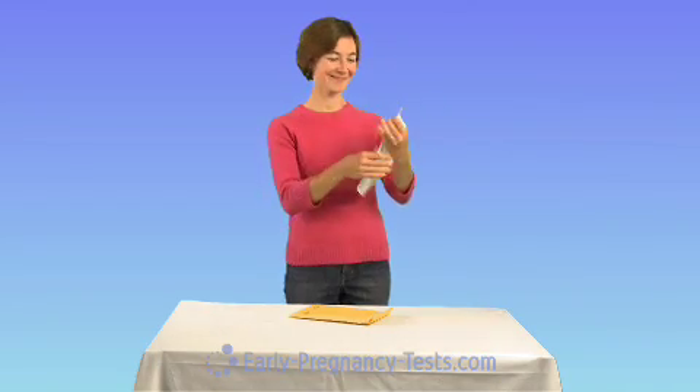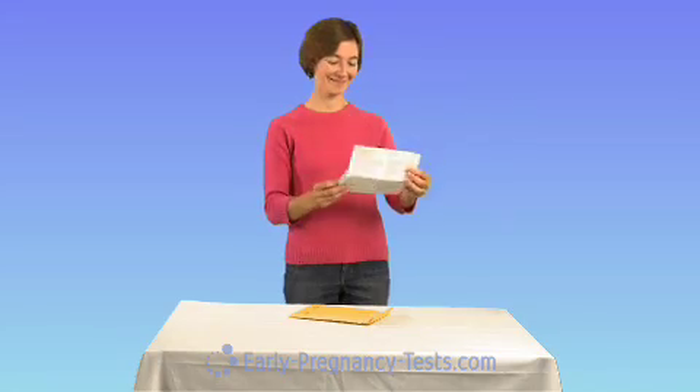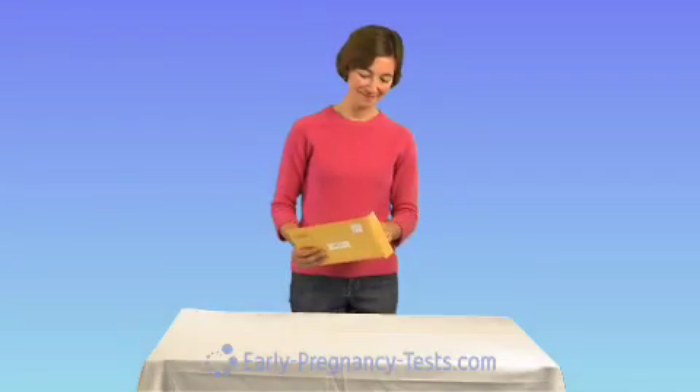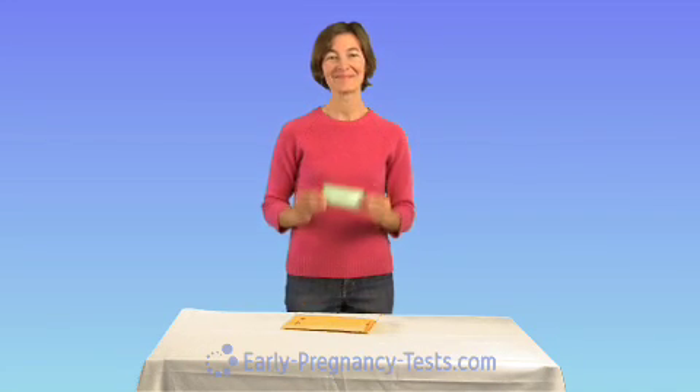When you open your package, the first thing you'll notice are the test instructions, complete with images to help you interpret your results. Please be sure to read the instructions thoroughly. Each ovulation test comes individually packaged in a foil pouch, and the test type is printed right on the pouch.